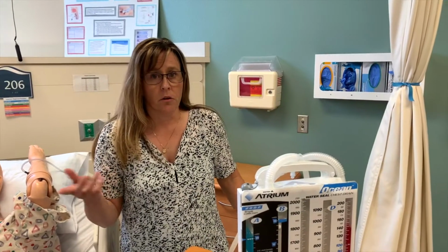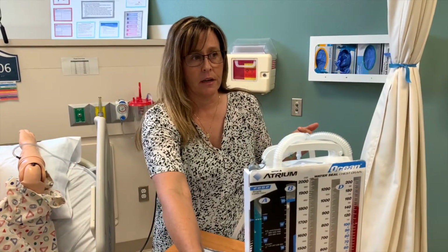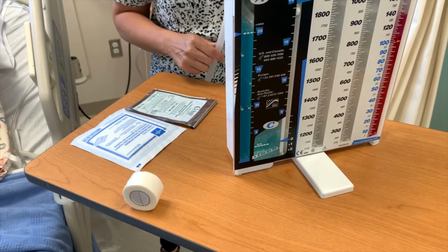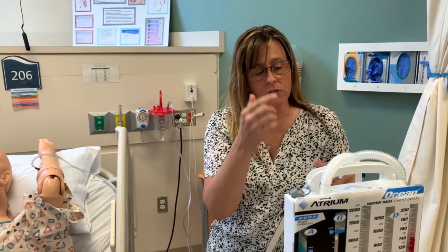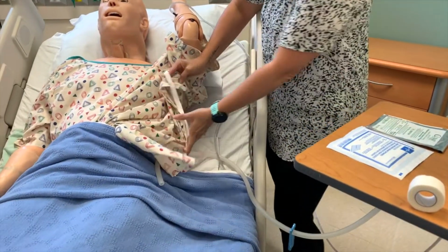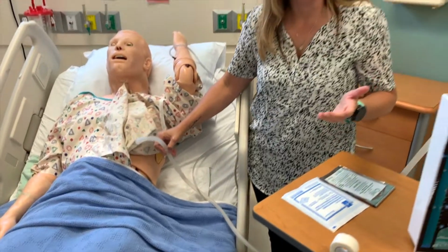All right, guys, so another complication, continuing with air leaks. I still have an air leak down there. It's showing me I still have an air leak. I looked here at my connector. My connector's connected. So it's not that. So then now I've got to follow my patient. I follow from my container to my patient. Hey, Mr. Williams, going to take a look. Uh-oh, it's come out. So what do I do?